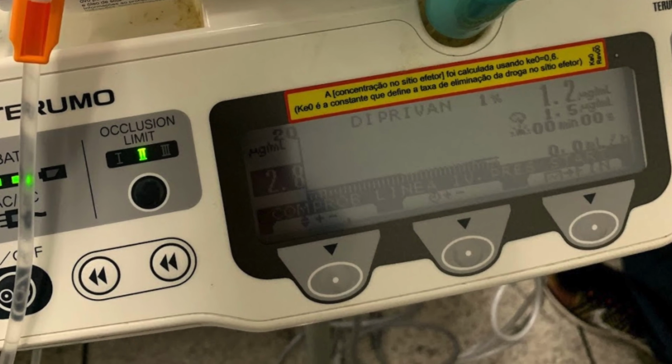So we go through the nose, an endoscopic exam. This endoscope goes through the nose and will film the throat. There in the throat is where the obstructions occur, the obstructive sleep apnea is given in the throat. The snoring is the vibration of this channel and the sleep apnea is the obstruction of this channel. And we, with this little probe, visualize the place where these events are happening.